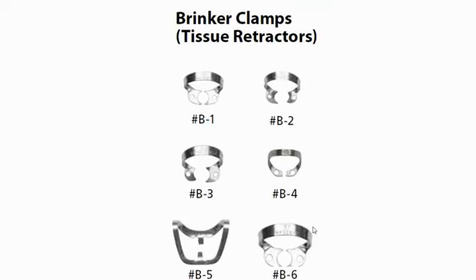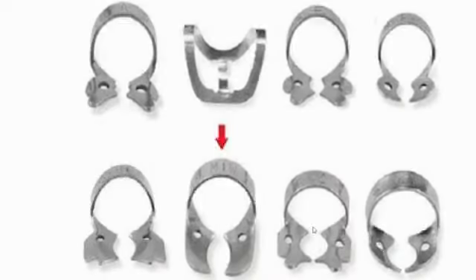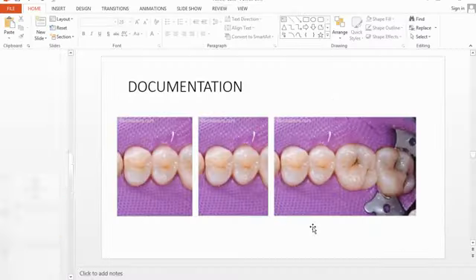तो क्लैम्प्स की आपके पास बिग इन्वेंटरी होनी चाहिए, क्यों? क्योंकि जैसे डिफरेंट डिफरेंट टूथ के शेप्स और साइज को आप एकोमोडेट कर पाए, और आपके पास जब मल्टीपल क्लैम्प्स होंगे तो रिपीटेड पेशेंट्स में आप यूज कर पाएंगे, ठीक है। तो these are the basics of clamps which I told you। Is it clear till now?